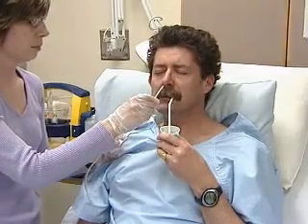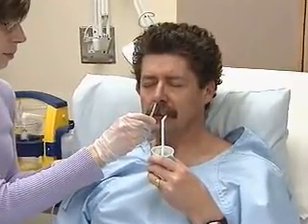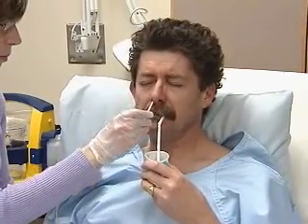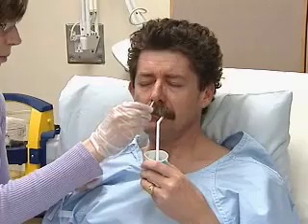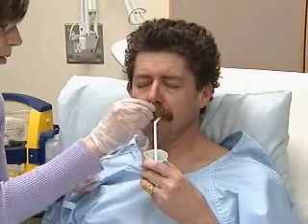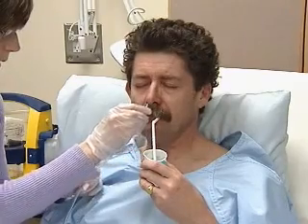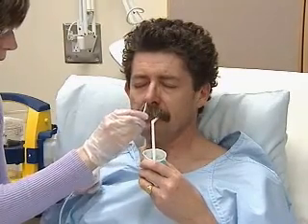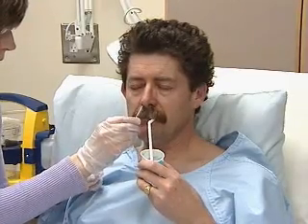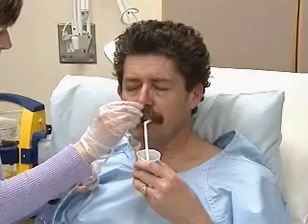With the end of the tube now just above the oropharynx, have the patient flex his head forward, take a small sip, and swallow. You'll advance the tube by an inch or two with each swallow. The patient may cough or gag if the tubing has accidentally entered the larynx. You can pause, withdraw slightly, and ease the patient with a sip of water. Be careful, there is a risk of aspiration.